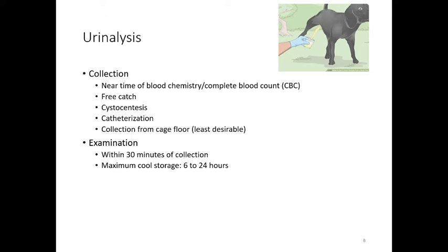If we are too rough with it, we can cause some damage to the urethra, so we have to be careful with that. We want to make it as clean and easy a procedure as possible. It is one way to get a urinalysis, and we also use catheterization for surgical procedures or for making sure we have a urethra that can pass urine. So there are a lot of different reasons we might use it.